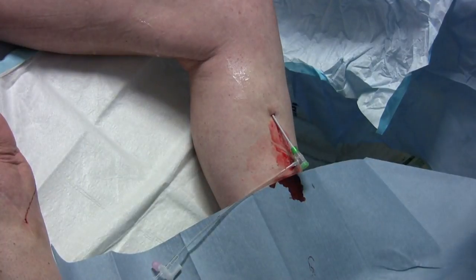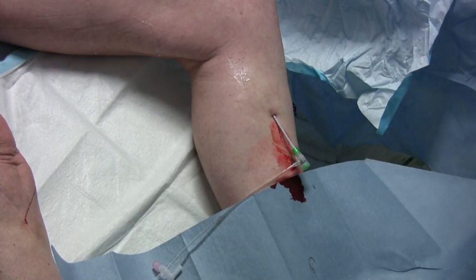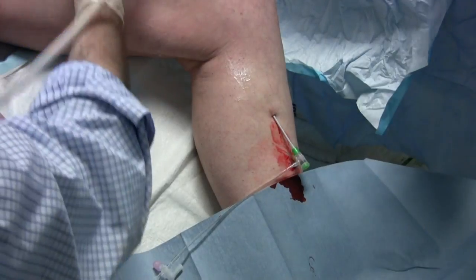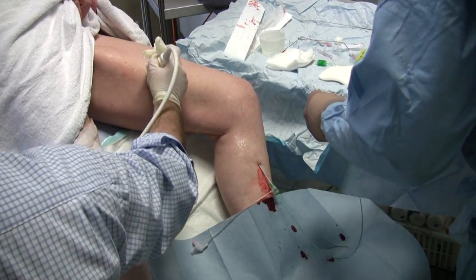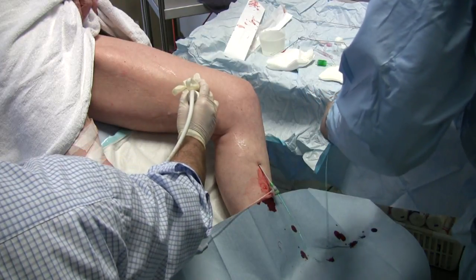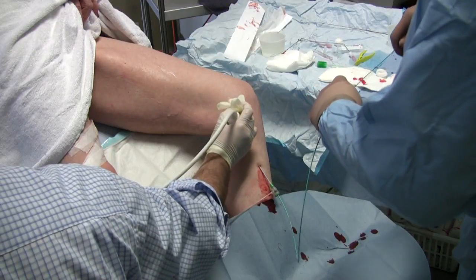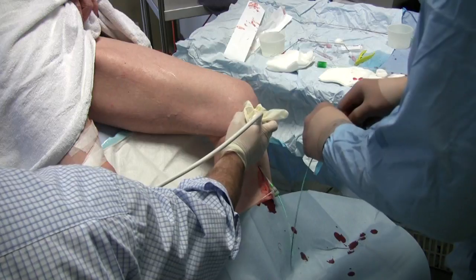This is followed once again by introduction of the guiding catheter into the vein, which is tracked up to the junction of the vein where the leakage occurs. This demonstrates the access catheter being guided by a guide wire to acquire the full length of the vein.